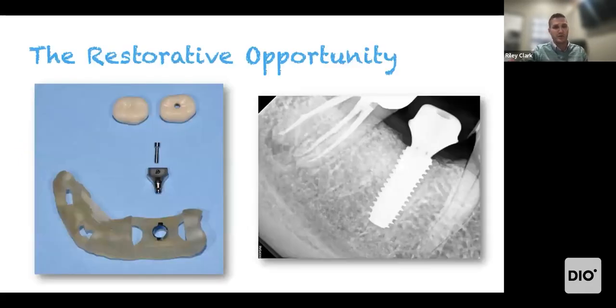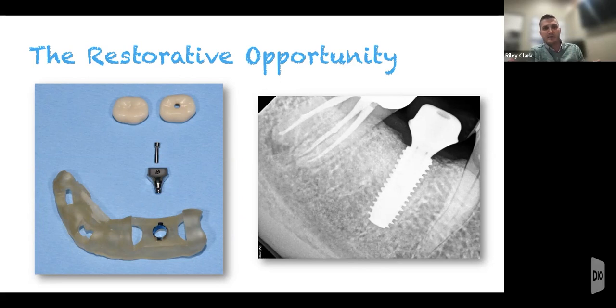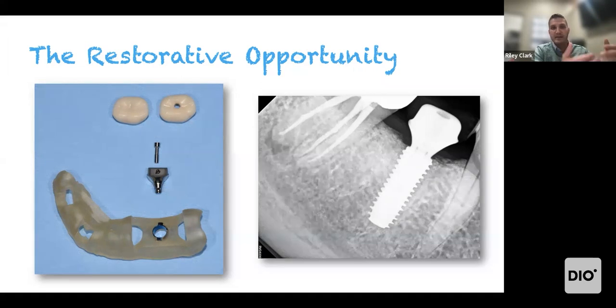And then this is what I call the restorative opportunity. What I mean by that is we today have such accuracy with surgical guides that the implant goes in with such precision, such accuracy, we can make custom abutments and have crowns made, temporary crowns, that go in the day of surgery. And they all fit, minor adjustments are needed. And that right there is the restorative opportunity. We see this on single units like you're seeing here in front of you, and also within full arch and complex cases where we can jump to restoration quicker, more efficiently, because we have a guide that is so accurate, the implant lets everything line up how we want.